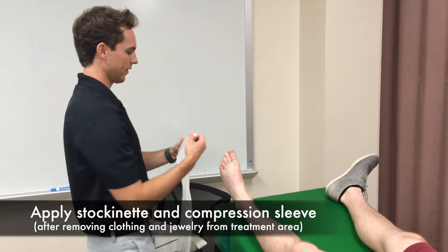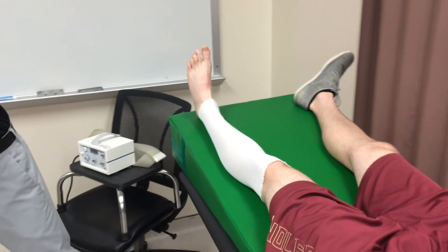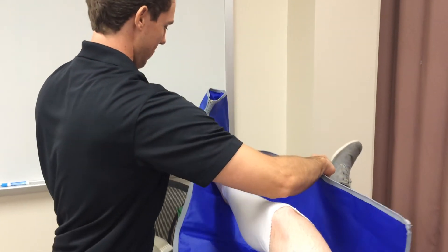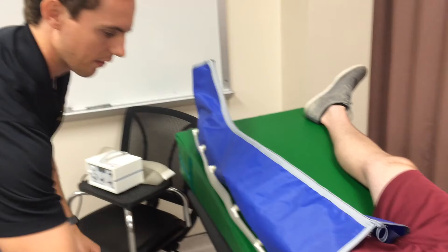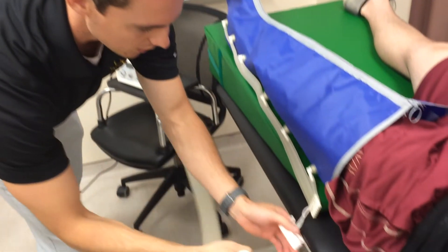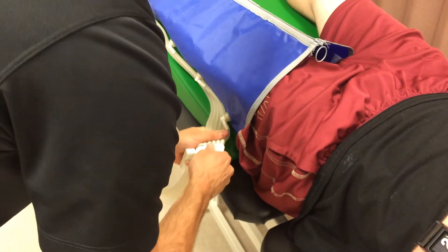Now that we've ruled out all the contraindications and ruled out DVT, we're going to apply the stockinette to the area of treatment. We want this stockinette to be over the entire treatment area and wrinkle-free. Now we can apply the compression sleeve over the entire treatment area. Next, we're just going to hook up the hose from the machine.